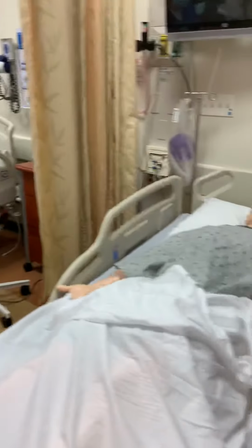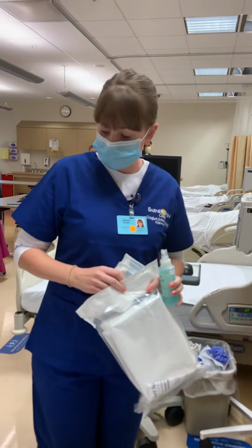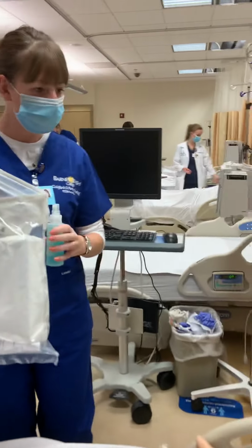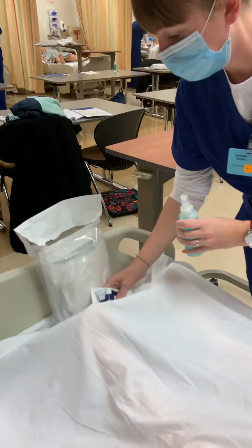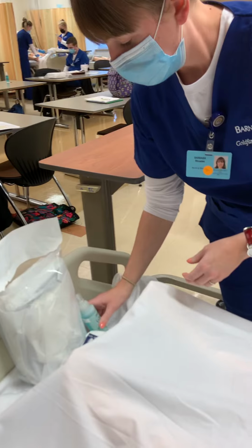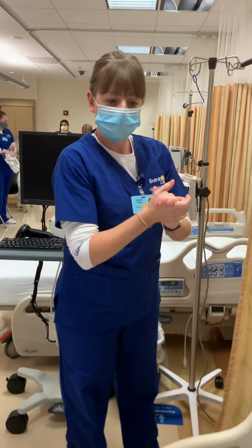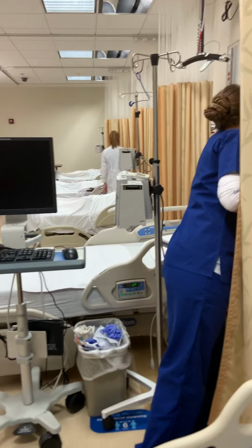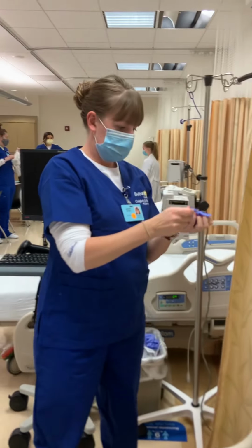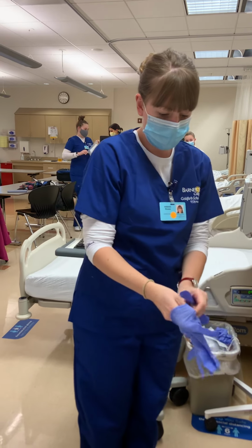Hello, how are you? I'm good, how are you? Good. My name's Barbara. I'll be your nurse today. Do you mind if I set some of this material down? No, not at all. All right, I'm just going to set it on your bed here for just a moment. And ma'am, can you please confirm your name and date of birth for me? Yeah, my name is Finn Utley and my date of birth is 12/24/1987. Right, thank you, Miss Utley.